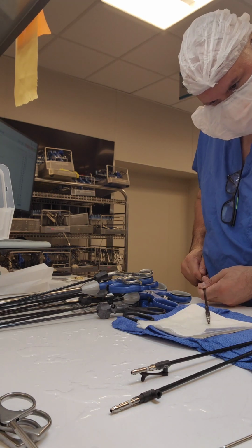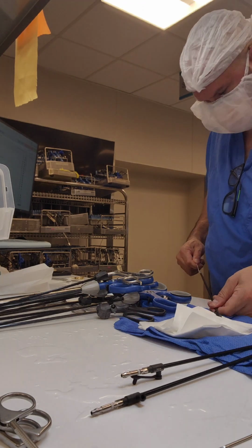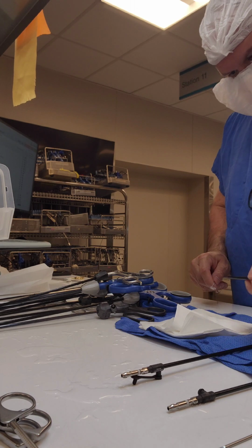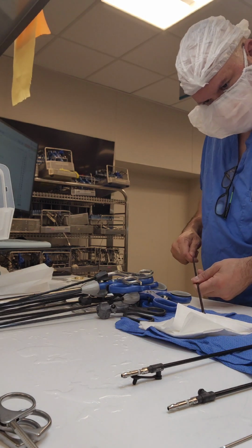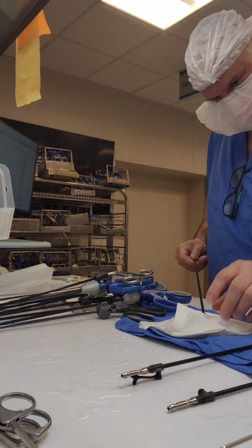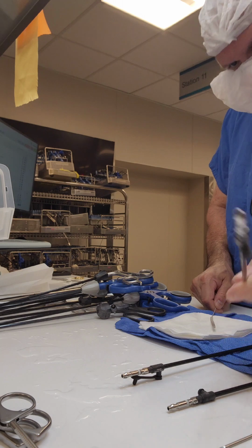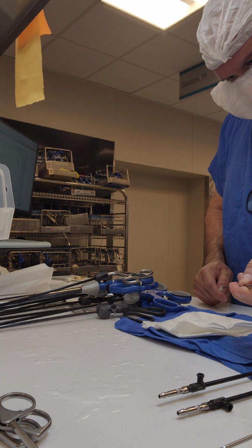All right, so for my items that are cannulated and that I moisten, I throw a brush through as well. Yes, I do use a brush on the prep and pack side. I'm against the toothbrush style brushes. Those brushes are not used for inspection. They are used to clean. Cannulated brushes are used to clean in decon, but can be used for inspection on the prep and pack side as long as you have a strong policy and procedure supporting that practice.